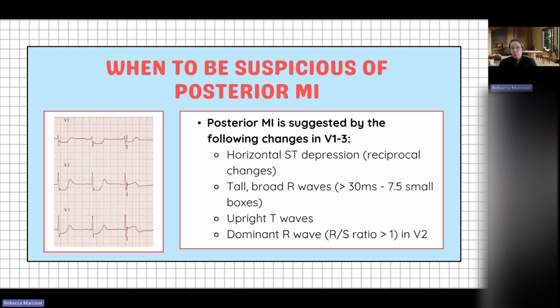This should prompt you to do a posterior ECG, even if this is the only finding on your ECG, because it could be an isolated posterior infarct.